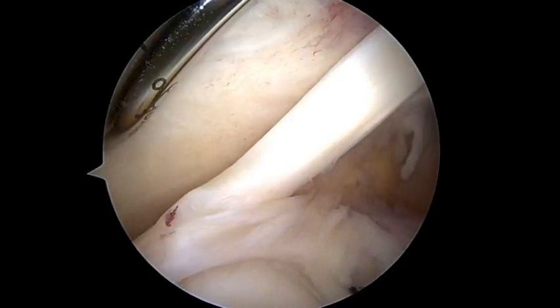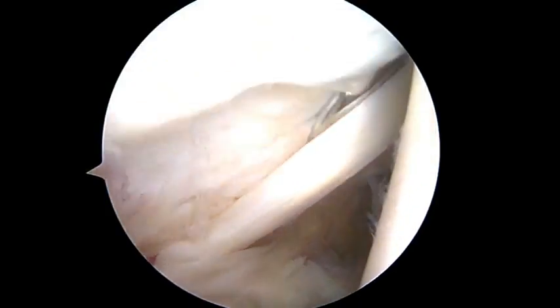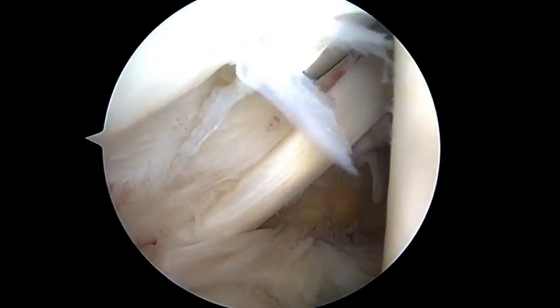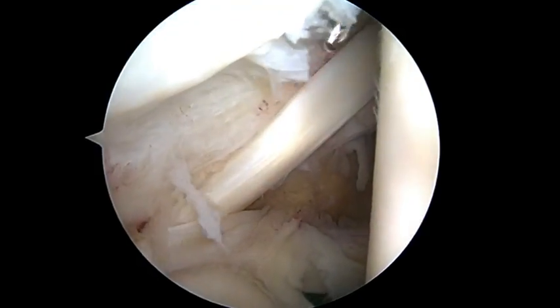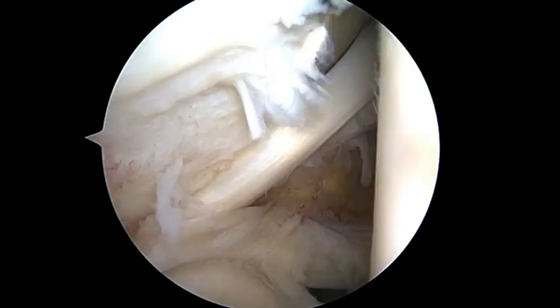The narrowed nose can go into multiple crevices very easily. And now you see that once I've done the synovectomy, I'm now moving to the rotator cuff and can easily, sharply, and cleanly get a nice edge of the rotator cuff tissue, which we're later going to do an arthroscopic repair of.